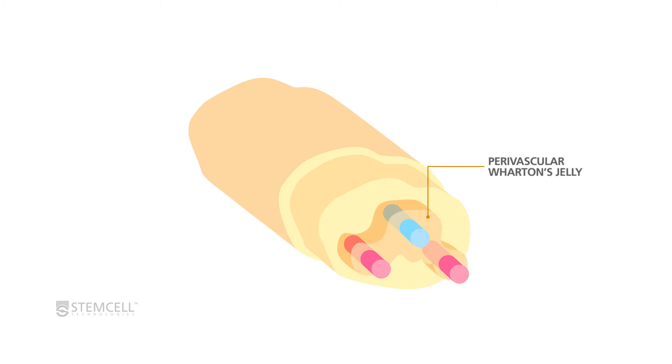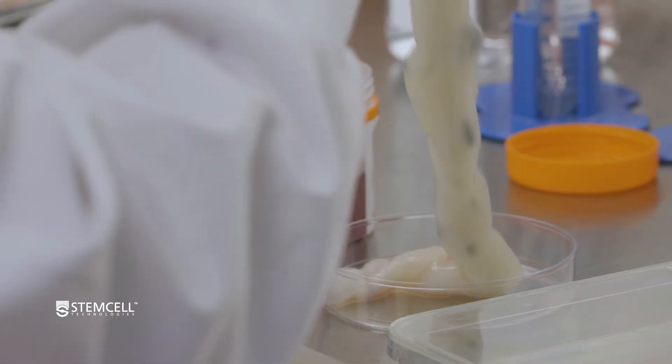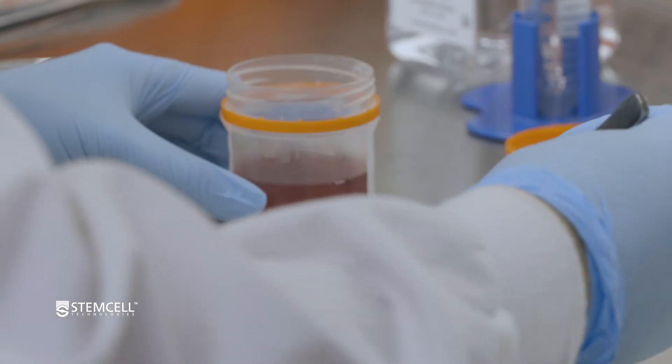We are now ready to dissect and prepare Wharton's jelly tissue from the whole umbilical cord. Wharton's jelly is the gelatinous tissue surrounding the vessels in the umbilical cord. The tissue directly surrounding the vessels is called the perivascular Wharton's jelly and contains the highest concentration of MSCs. For highest MSC per gram tissue yield, it is recommended to use the perivascular Wharton's jelly. Umbilical cord must be dissected and plated within 36 hours of birth for optimal cell recovery.